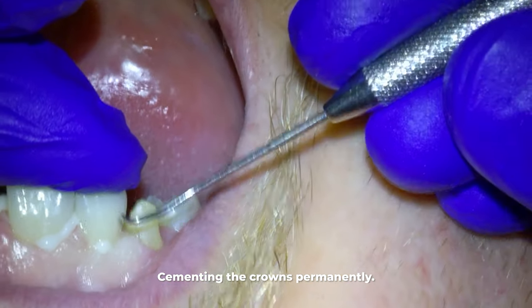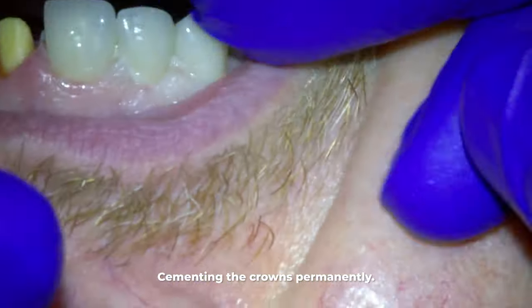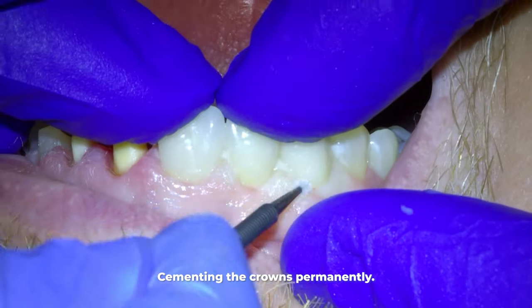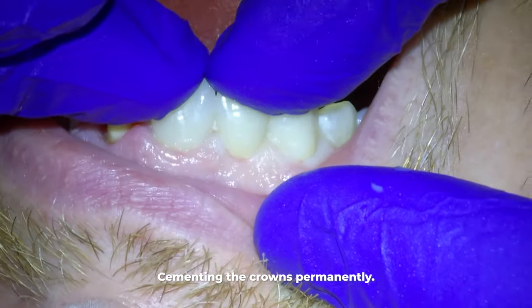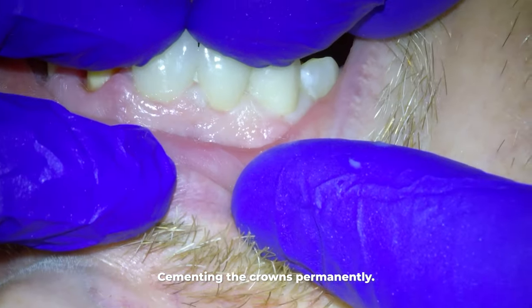He did not want them to be the exact same color. What I tell all my cosmetic patients is that as long as you are patient, we will get your teeth exactly how you want if you have reasonable expectations — sometimes that might take extra appointments. This patient, however, is ecstatic with the cosmetics of the crowns.